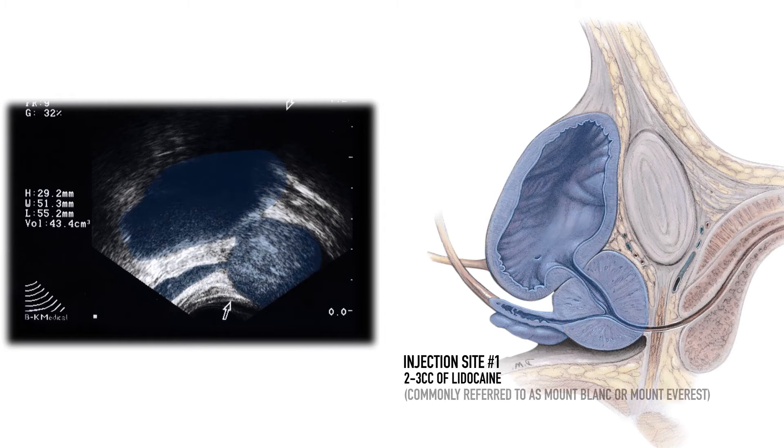My first injection site is located here. This site is commonly termed Mount Blanc or Mount Everest, and refers to the hyperechoic notch between the prostate and the seminal vesicles, created by the fat between the rectum and the seminal vesicle. I will be injecting 2 or 3 cc's in this area.